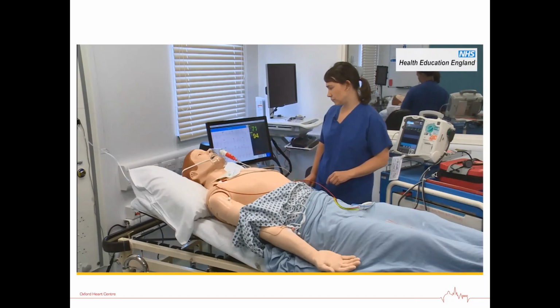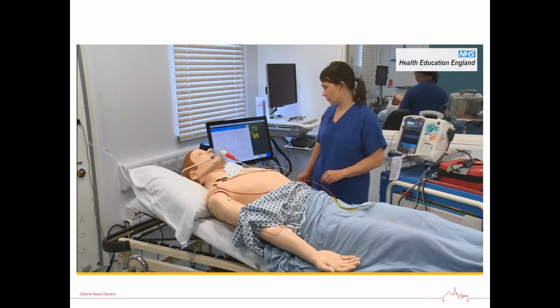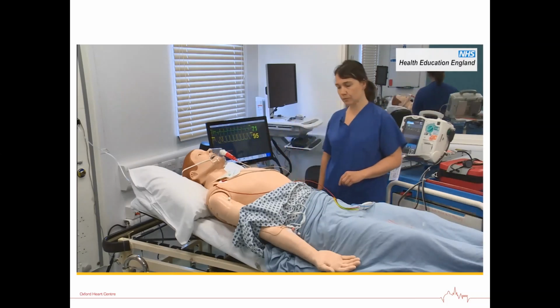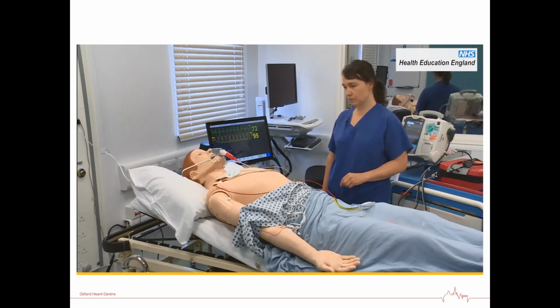Okay, so we do have pacing spike followed by QRS. Good. And we've confirmed mechanical capture. Our blood pressure's come up, which is good. If it hadn't come up, you obviously consider sepsis and hypovolemia. The patient's in heart failure, you can accept a lower blood pressure than normal, because the most likely cause of this low blood pressure has been complete heart block.